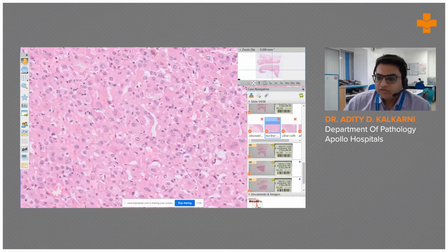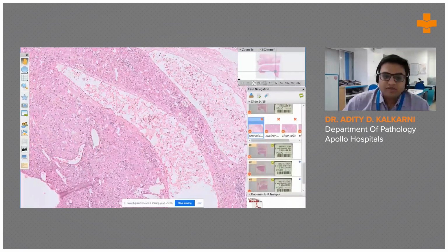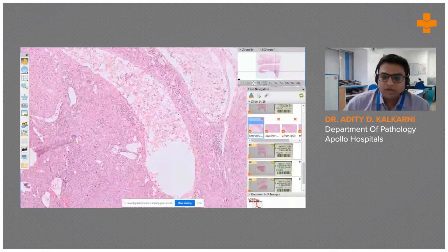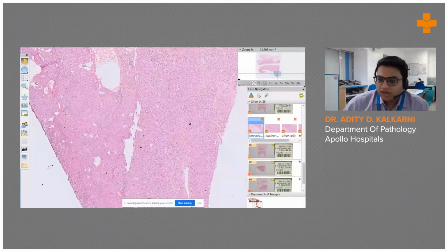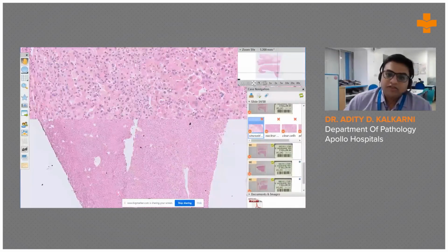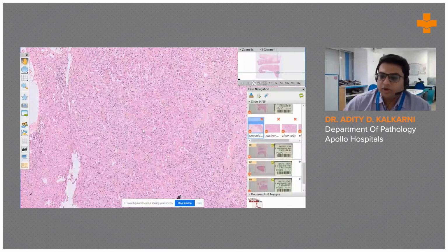There are foci of sinusoidal invasion. As you can see in this, within the tumor, the sinusoids are showing scattered tumor cells within the lumen, but there is no venous invasion in multiple sections. We took some 10 12 sections, and there was no venous invasion. There was also a very scanty mitotic activity, which is also a very important finding. As you know, in adrenal cortical neoplasms, we study around 50 consecutive high power fields, and in those, we found around 2 or 3 mitoses.